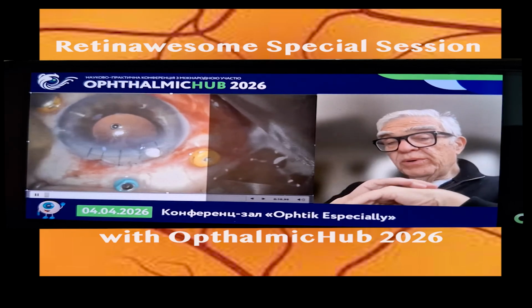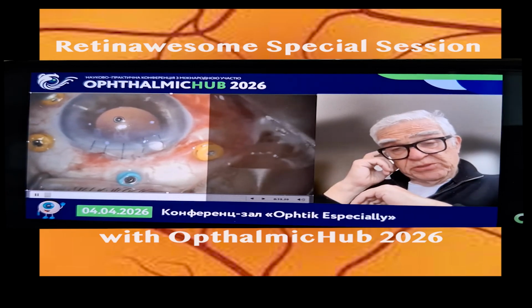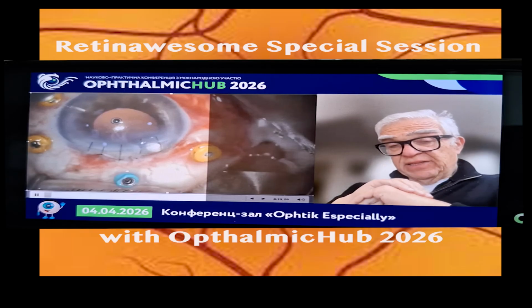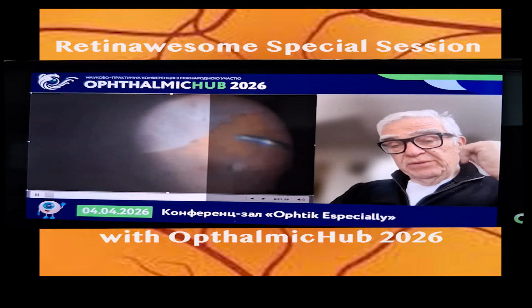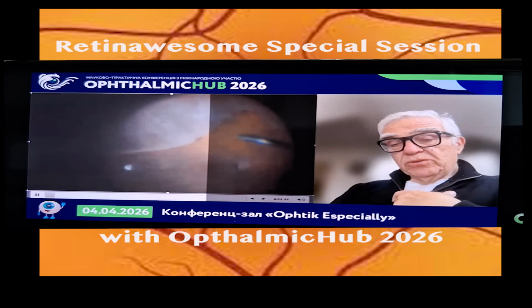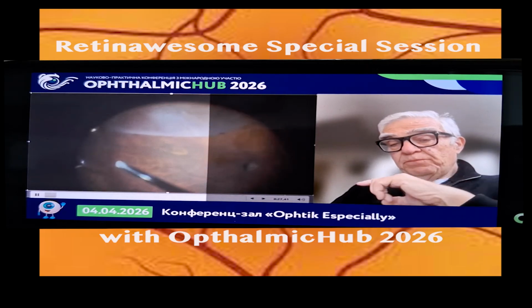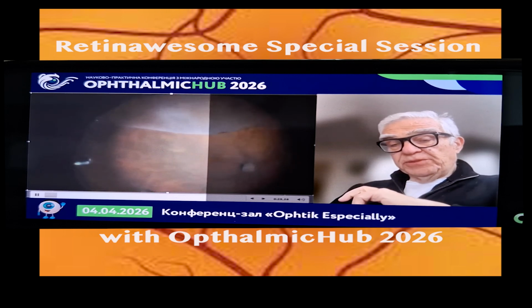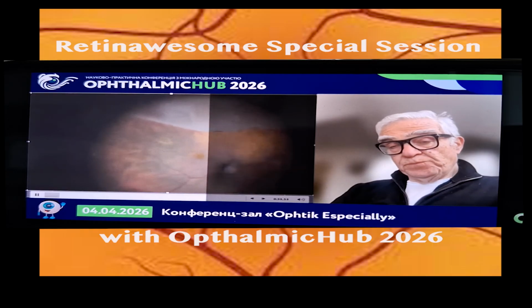We always use a chandelier light for bimanual surgery, for posterior segment surgery. I love that thing because you need both hands. So while we did the vitrectomy, we couldn't find the nucleus, but we found the inferior detachment. So where's the nucleus that is supposed to be there?